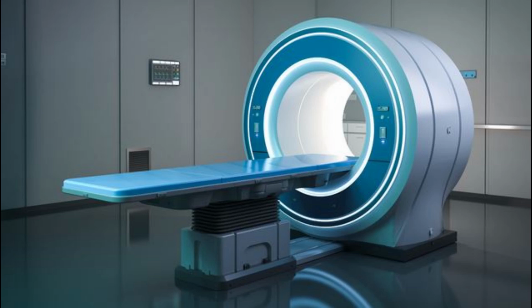Outside this, its use in zoology is limited due to the high cost, but it can be used on many species. In paleontology, it is used to examine the structure of fossils.